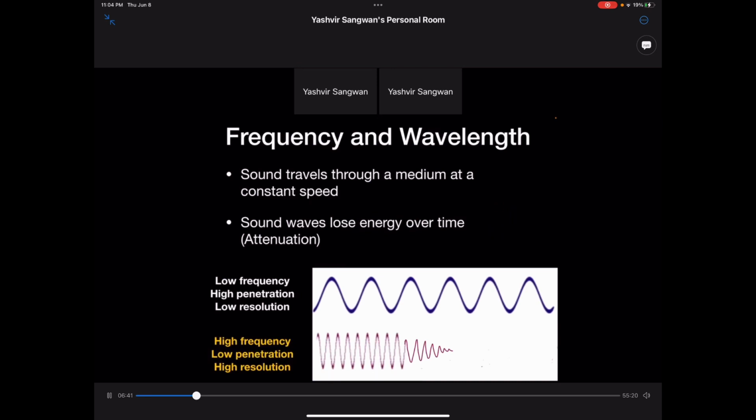Let's talk about sound. In any given medium, the sound travels at a constant speed. Air is a bad conductor of sound. Right now, you are listening to this lecture. If you keep walking away from here, there will come a point where you don't hear me anymore. And the reason is that over about 200 wavelengths, the pressure wave dissipates because it gets scattered by the molecules in air.